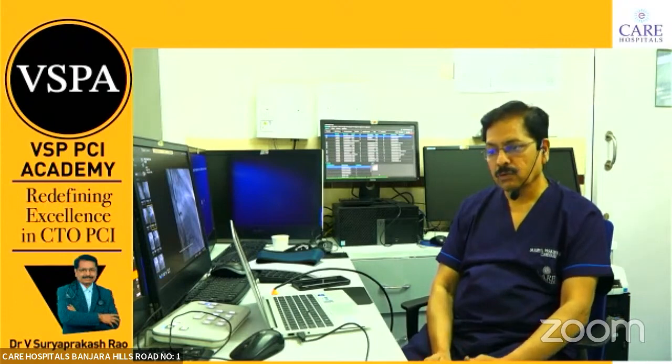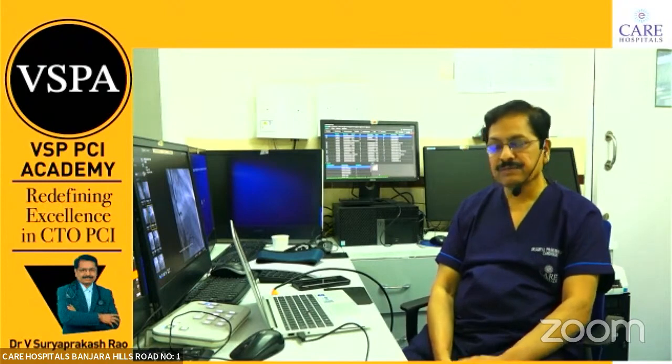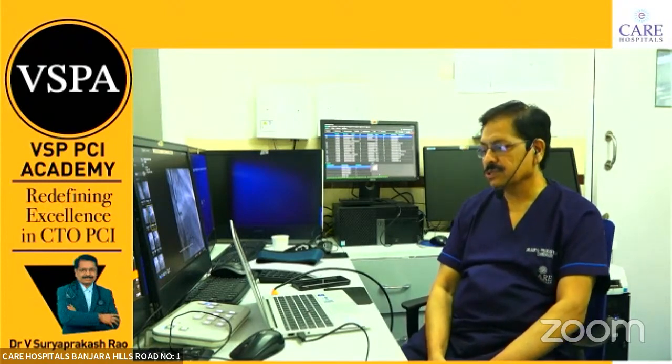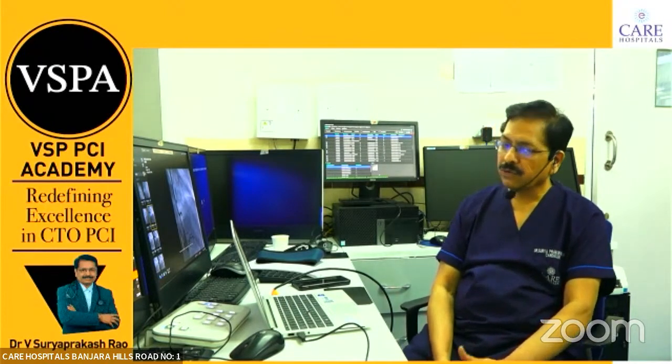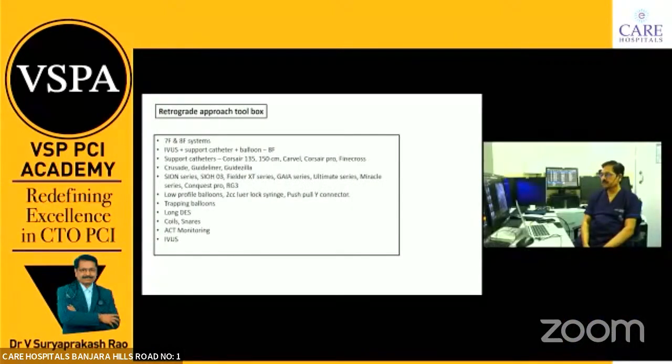The tapering tip comes, and the hydrophilic nature, the hub, holding the hub, this is shaft strength. So these are the things based on which many catheters are being upgraded and coming into the market, and visibility. Very important. If you don't have a good cath lab, then the visibility of the tip of the catheter is very important. Suddenly, the hydrophilic catheters can come out and you don't see anything. That's why visibility of the lab is also very important.